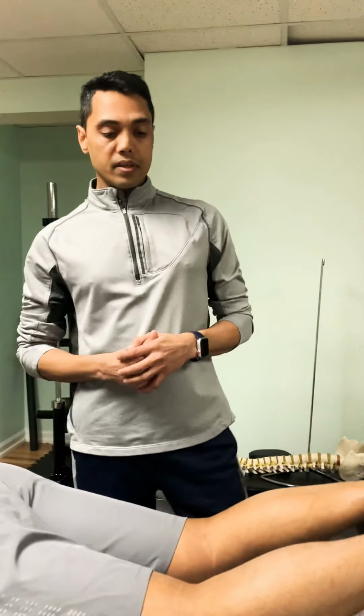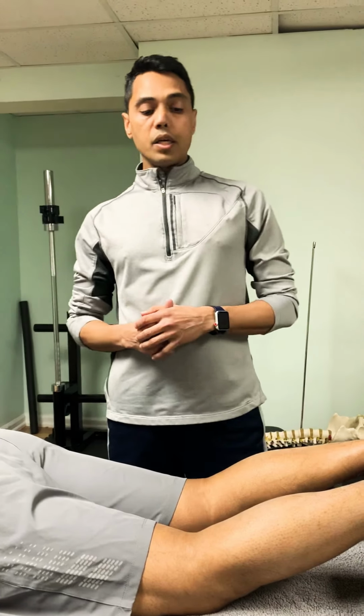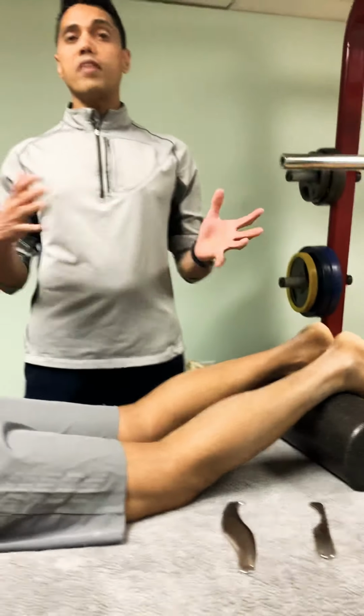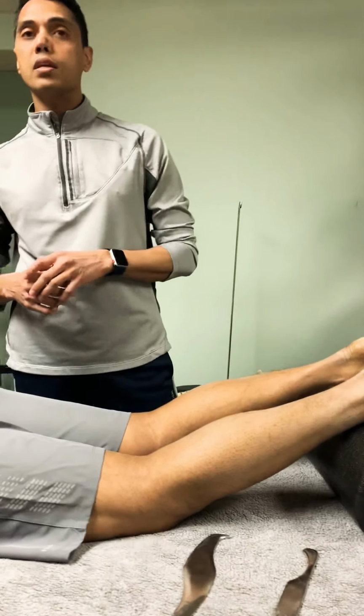Before I get started, I want to tell you that you could use tools of different kinds. You could use your hands all day to mobilize the soft tissue and the fascia, which is your connective tissue. But I'll tell you why it's better to use IASTM.